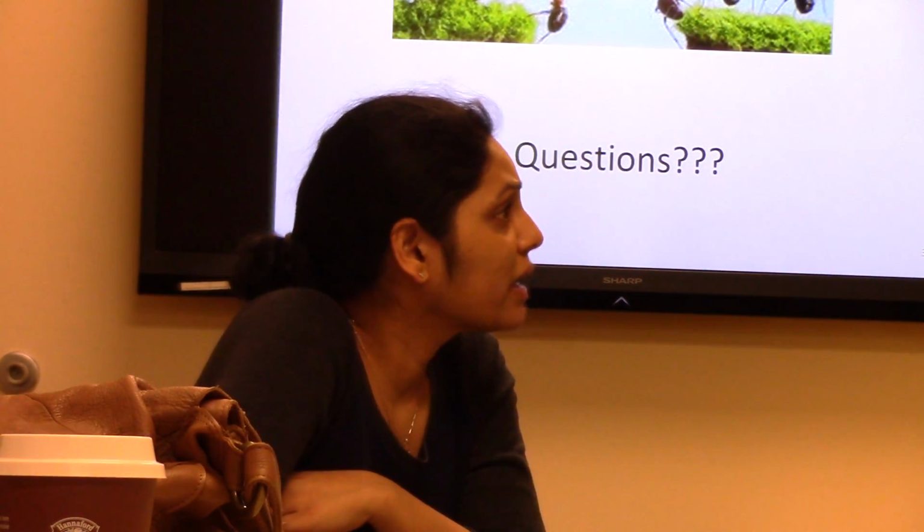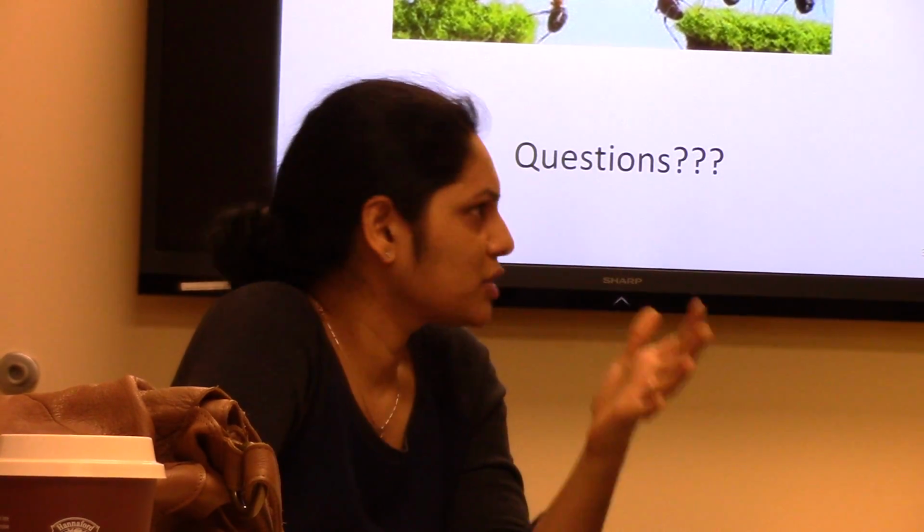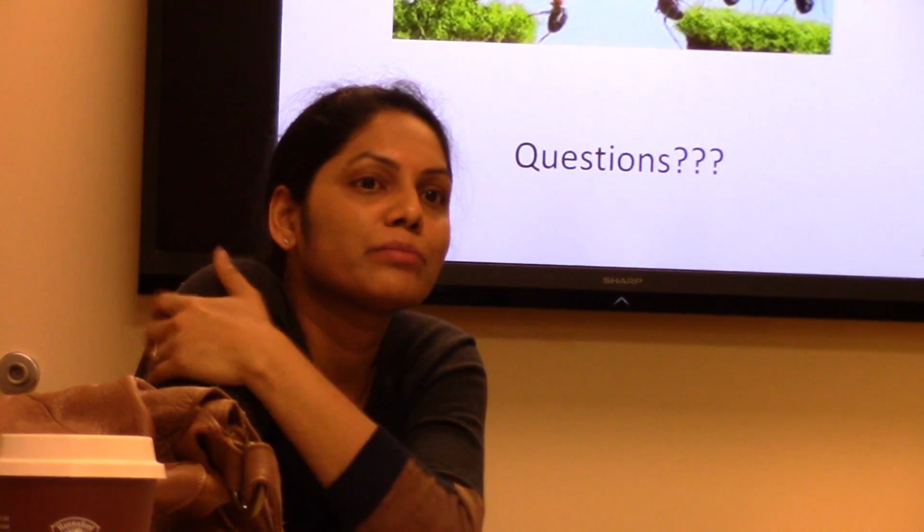Since they've been coming through the PACU, the ones that we've recovered and gone to the floor, have you seen any of them come through? It's actually, we are sending them home a day sooner, and the patients appreciate it. That's amazing. Yes, we are seeing a lot, and that's why we are actually doing this. Send them to PACU instead of putting them in SICU. How many hours post-procedure are they up on their feet? I usually say 6 hours, unless they have a complication. Complication being bleeding issues or rhythm issues? Bleeding. Yesterday, for example, out of those 3 patients, one had a hematoma, so I had to keep her on bed.